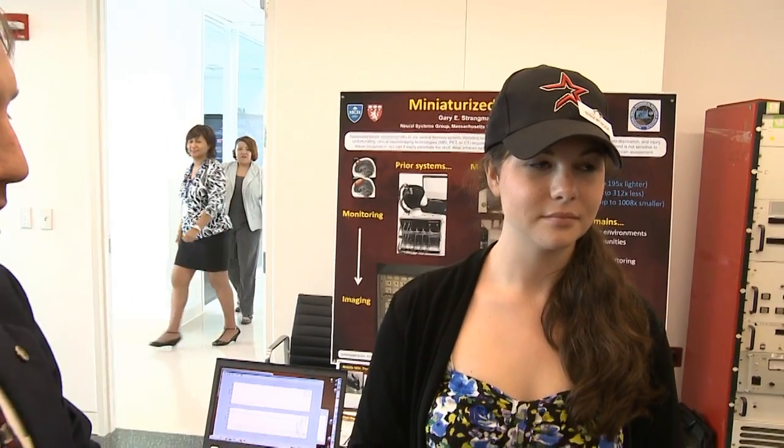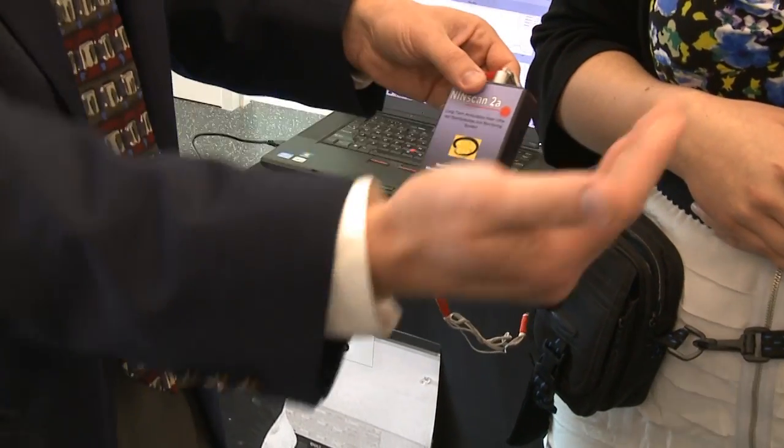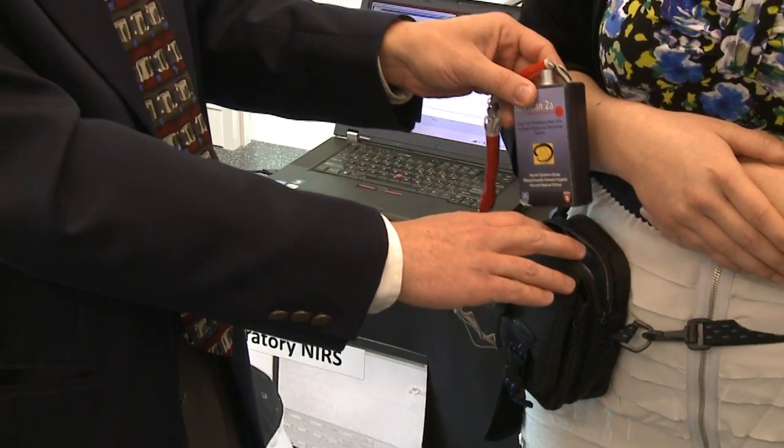This is the entire size of an MRI boiled down to get similar measurements. We're getting blood volume and blood oxygenation measures just like you would with a functional MRI scan. The device itself that collects all the data is right here, and we have a series of them that are progressively more complicated, allowing us to collect more auxiliary and optical information. That's compared to the big devices down here — full-size laboratory devices — that one's an imager at 150 pounds and is not something you're going to strap to your back and walk around with, whereas this one is designed to achieve that goal.